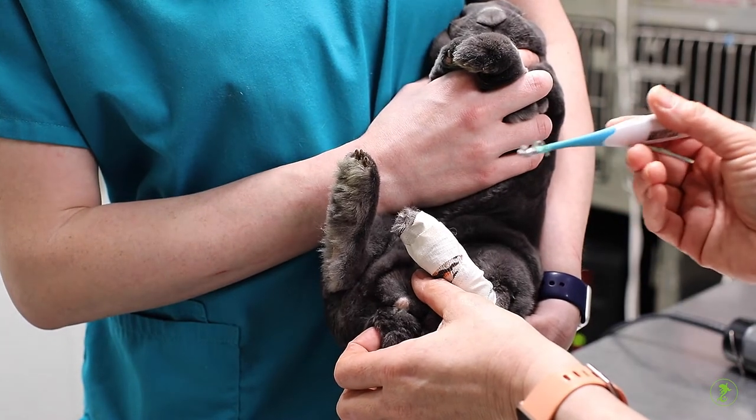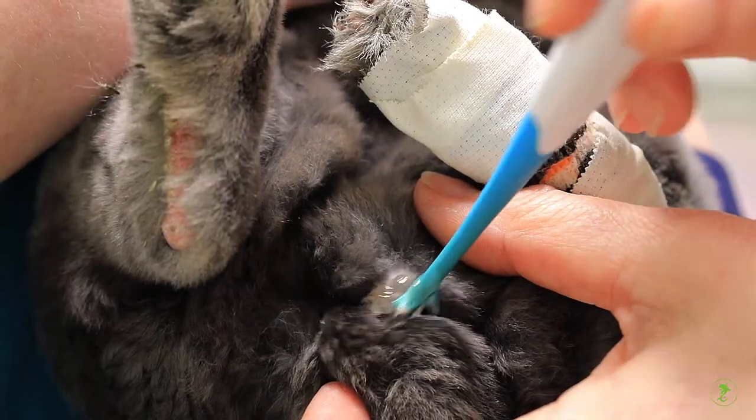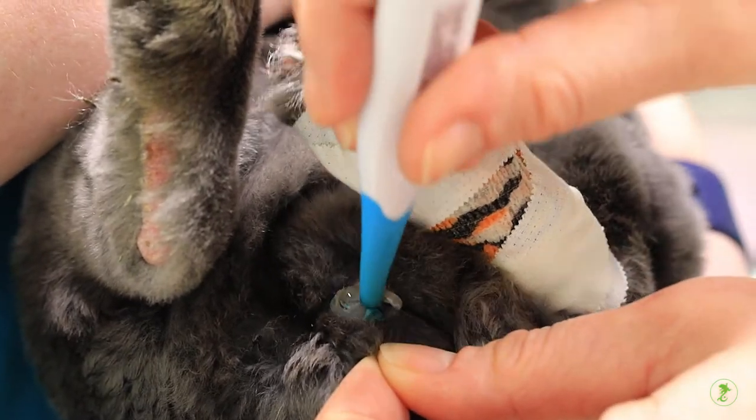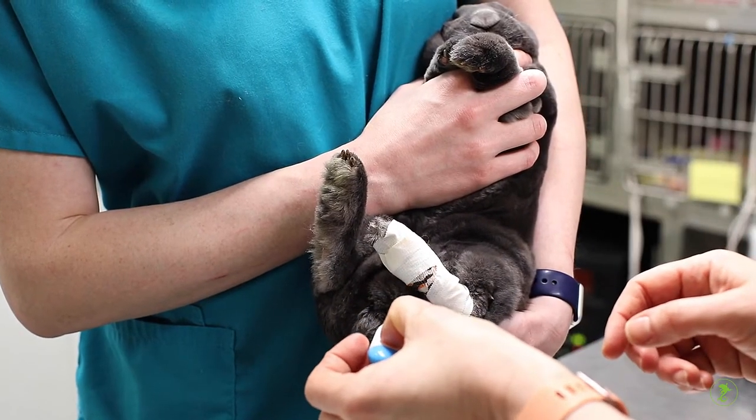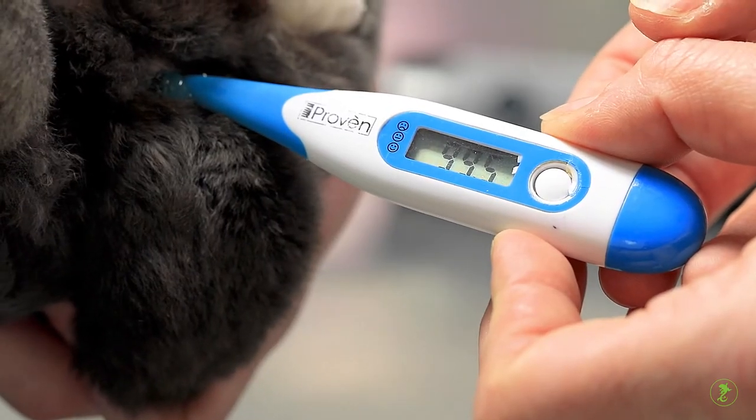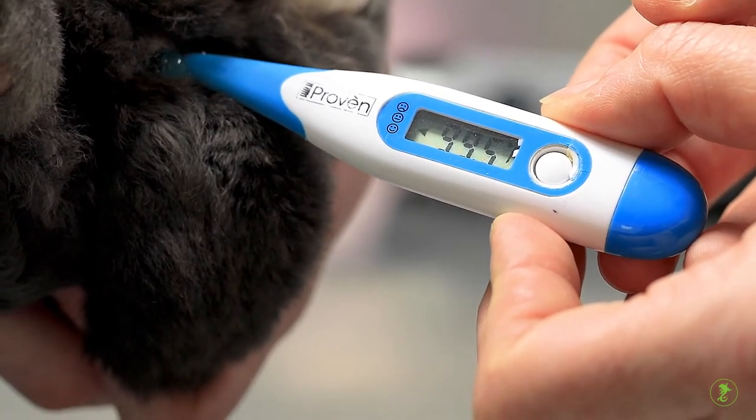For rabbits, it's often best to gently place them in a sitting position. The rectum is always the opening closest to the tail. Gently insert the thermometer as far as it will go without encountering any resistance.